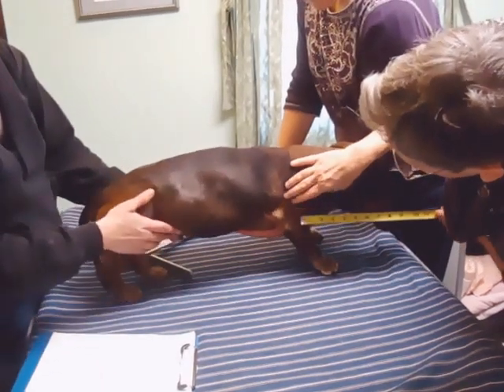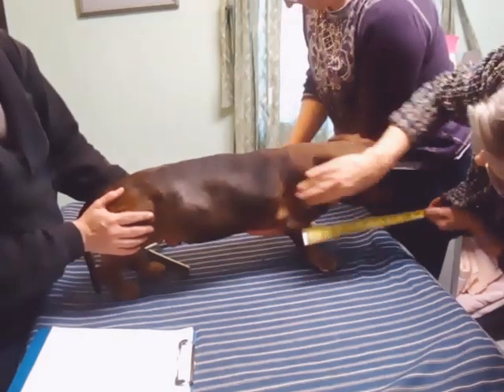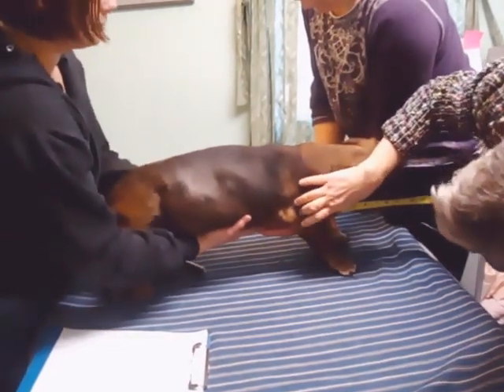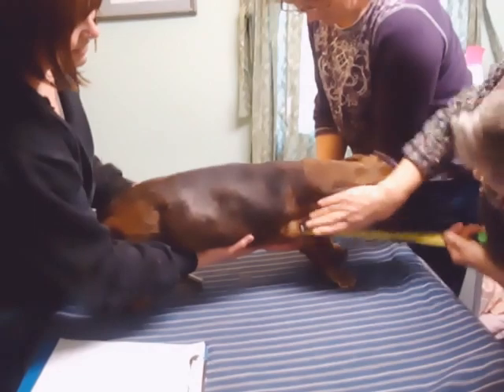For G, it's from the center of the shoulder to the point of the chest. For a front wheeler, this is a critical measurement because it positions the wheels. For a quad, it tells us how long the hold-on is. We're getting four inches.